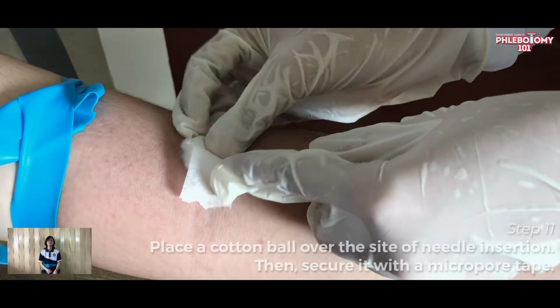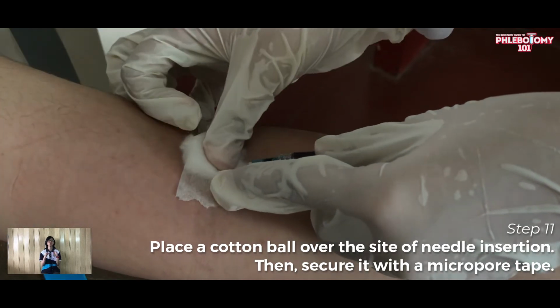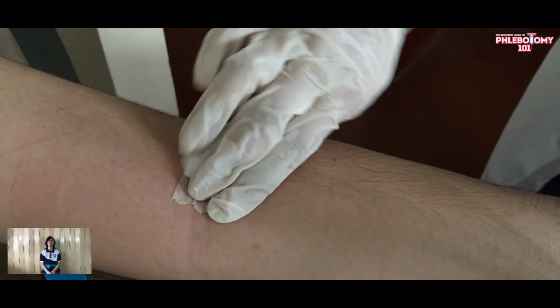Step 11. Place a cotton ball over the site of needle insertion and then cover it with a micropore tape. Dahan-dahan alisin ang needle and activate its safety feature kung meron.